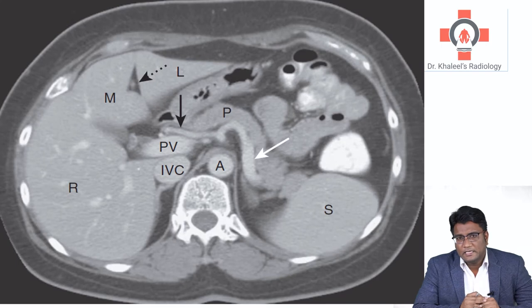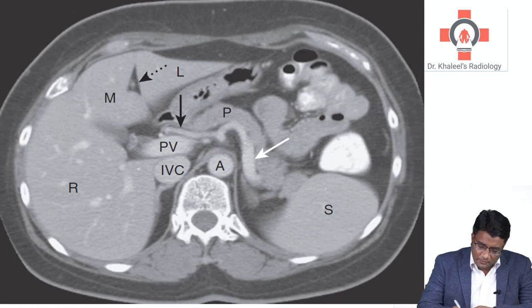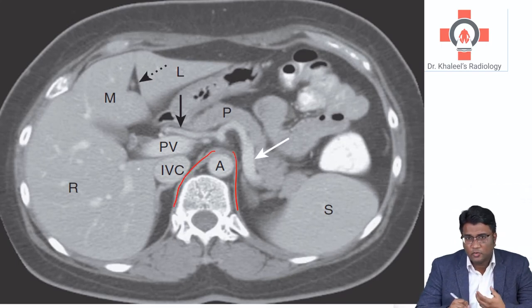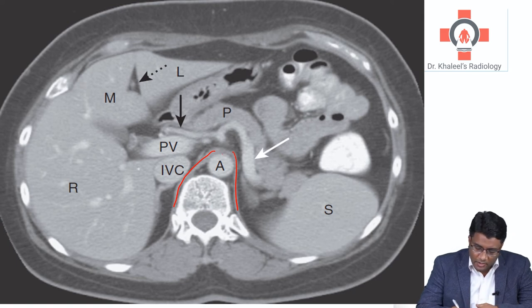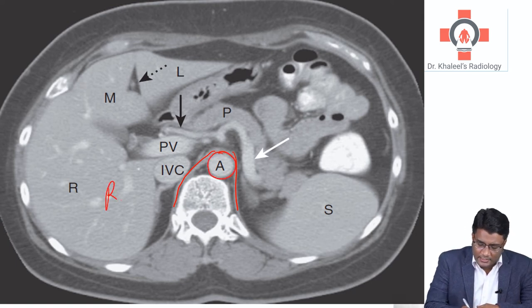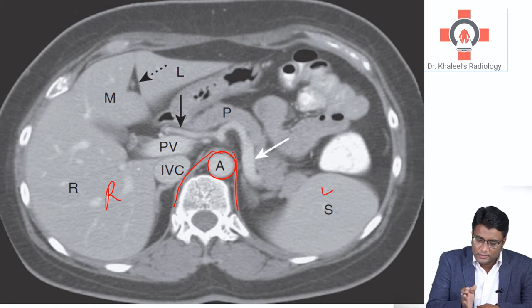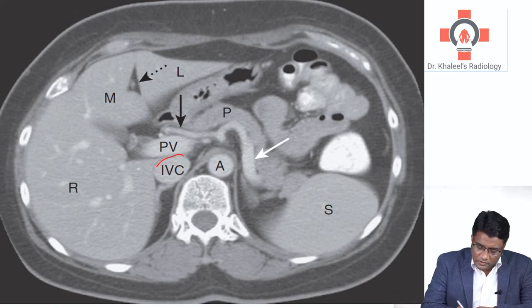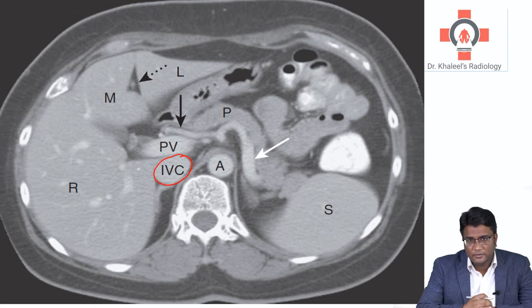Look at this image again. You can see between the right and left crura of the diaphragm — between the crura of the diaphragm — you have the aorta. To the right of the aorta is the right side, and to the left is the left side. So towards the right of the aorta we have the inferior vena cava.